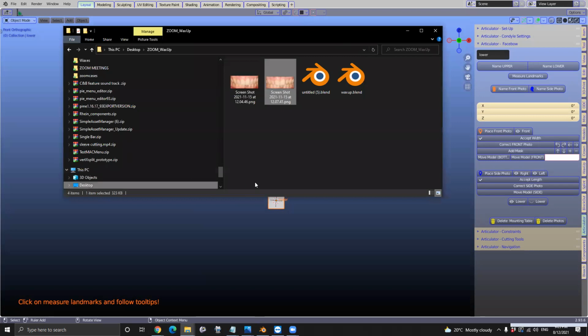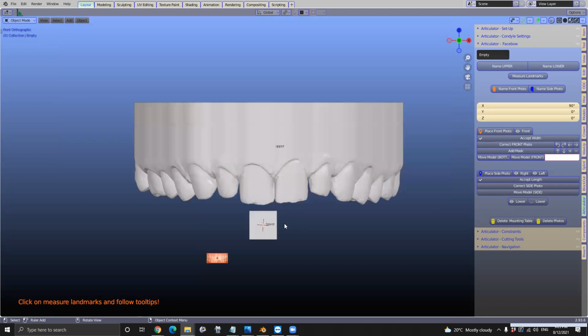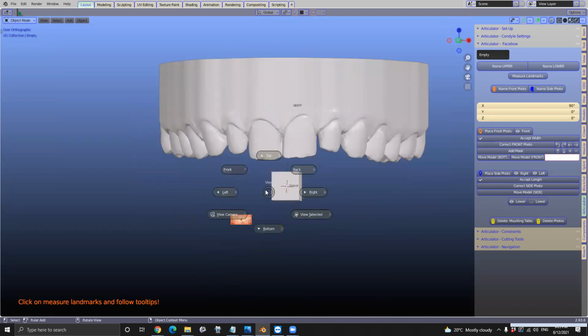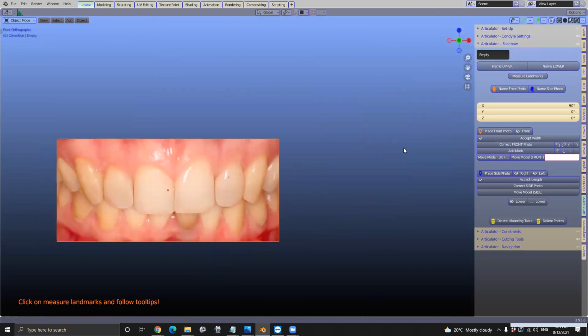Wolfgang, can you see this picture here? Yes, I can see it. Yeah. Okay. So this is the photo that's been given to me. Take this back. And now I just want to mention how we do these photos. Wolfgang, maybe your input would be quite good with this one here now.